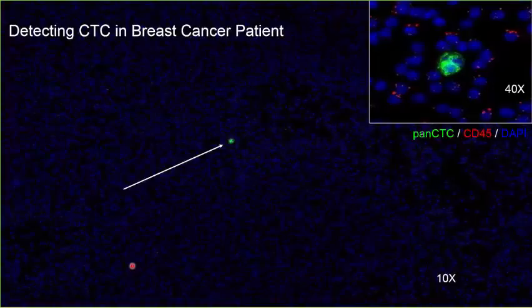RNAscope can be employed in both chromogenic assays, as shown in the previous two examples, as well as fluorescent assays, as shown here. In this example of CTC detection in a breast cancer patient, RNAscope target probes for CD45 positive bone marrow derived cells and for pan-keratin positive circulating tumor cells were used in a duplex assay. CD45 positive cells show punctate red dots, whereas the CTCs are highlighted by clusters and clumps of green dots.